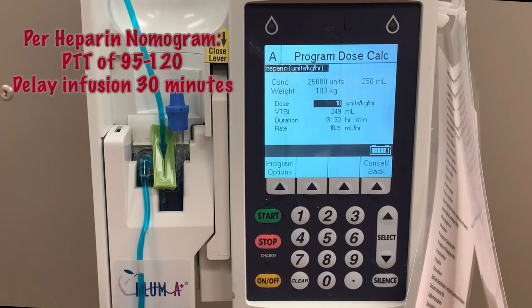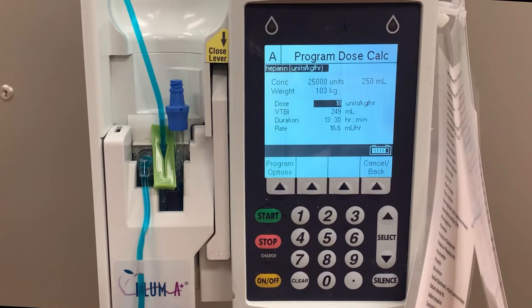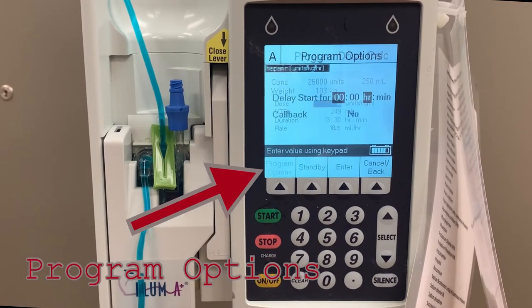When administering a heparin infusion, if the PTT comes back between 95 and 120, the medication needs to be stopped for half an hour and then restarted at a slower rate. From the Program screen, press Program Options.